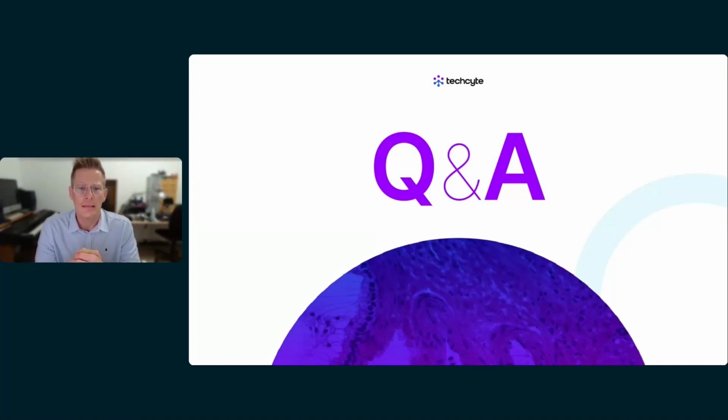Patricia asks, does it recognize yeast forms of blastomyces? Now, currently the yeasts that we're able to detect are in AI, they're in our vaginal, the BV detector.